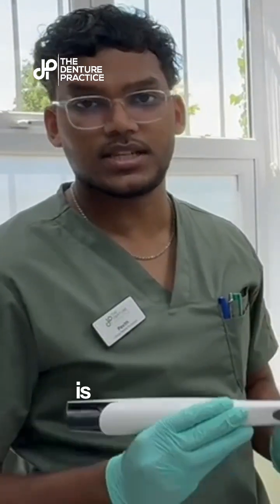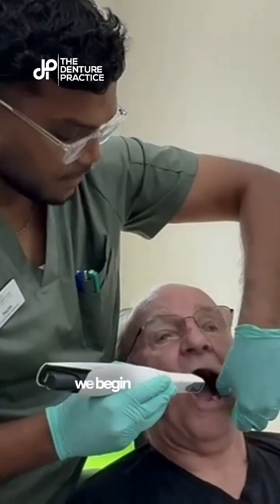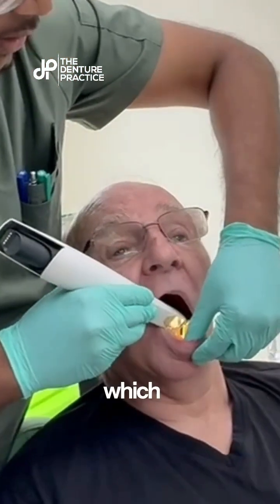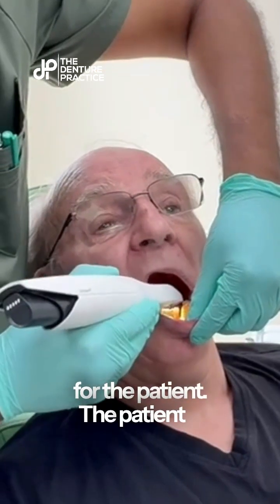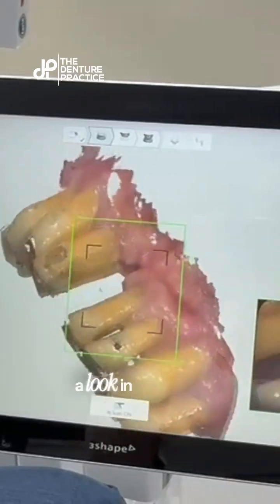The first stage of the appointment is an oral scan. We begin by scanning the mouth, which is very painless. There's no gagging — it's quite easy for the patient. The patient is quite comfortable, and you can have a look at the screen.